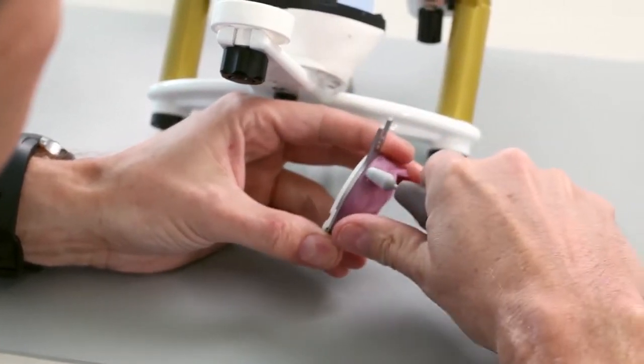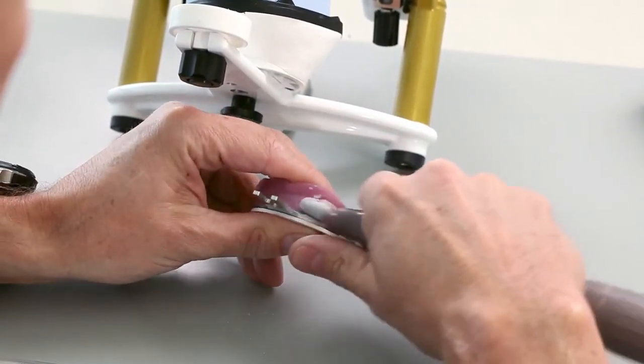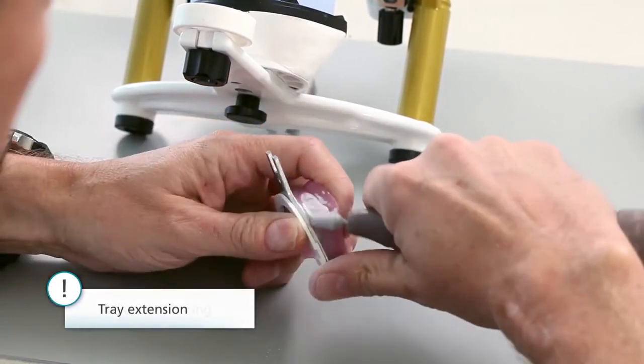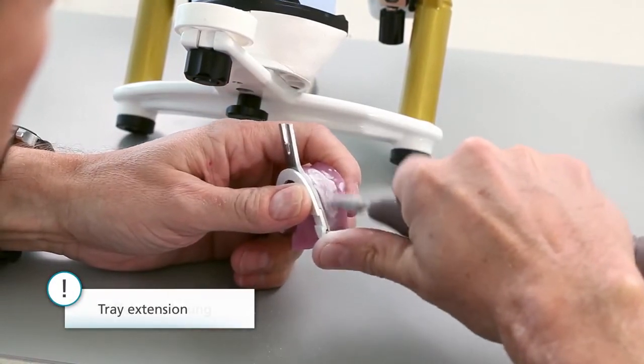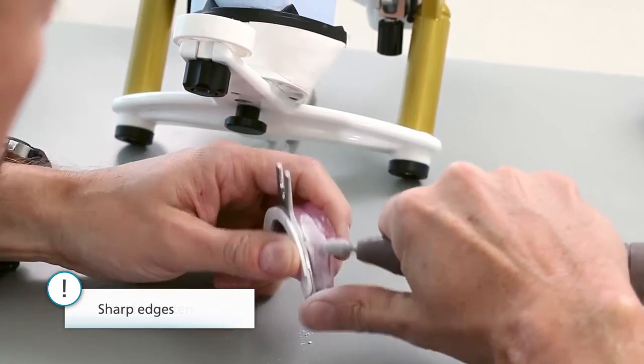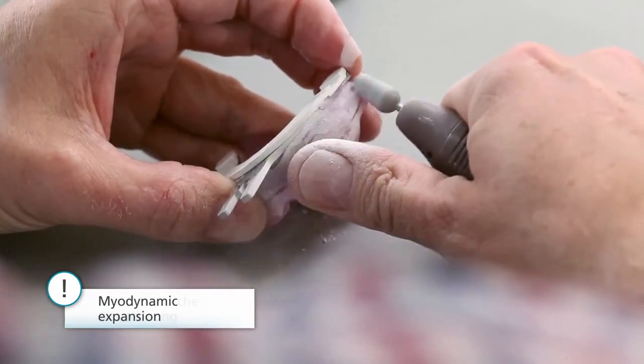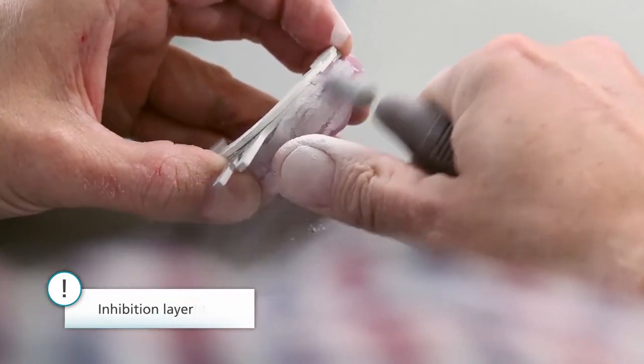Finish the custom trays with the integrated intraoral registration. Check the tray extension and adjust if necessary. Smooth out sharp edges. Keep the movable parts of the mucous membrane unobstructed. Observe the myodynamic expansion. Remove the inhibition layer.